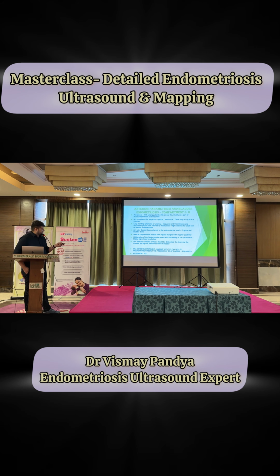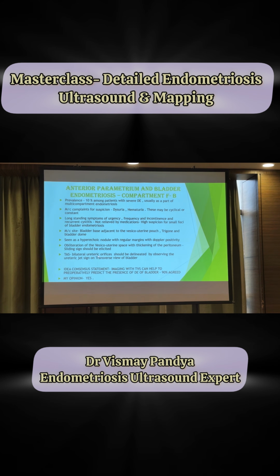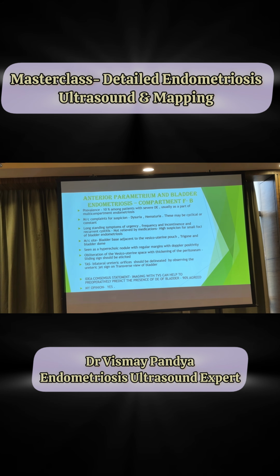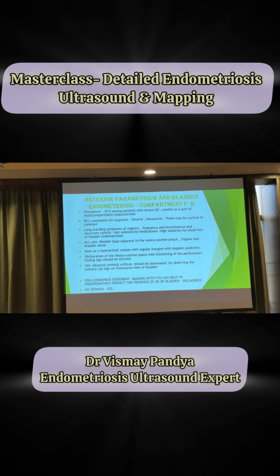There is a place for transabdominal sonography in the bladder, because you can just put a probe and delineate the bilateral ureteric orifices. It's nothing complicated, just simple. You put a Doppler window on it and you just wait. You will see these ureteric jets beautifully coming from below.